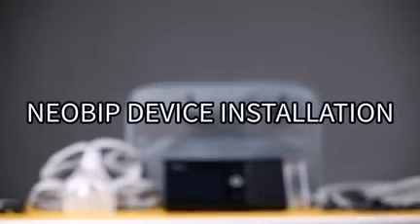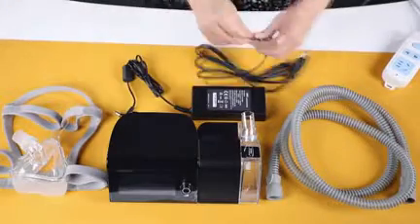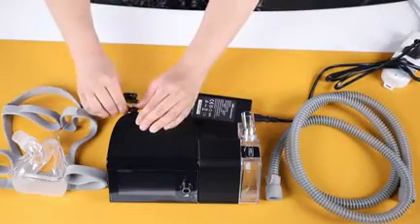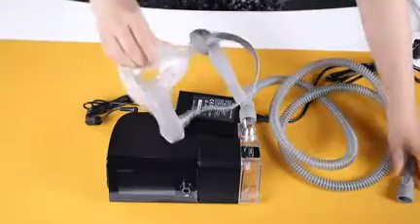Today, we're presenting the installation of the NeoBiP device. The installation is pretty easy. You only need to connect the power to the device and the tubing to the air outlet and the mask. Let's see more details.